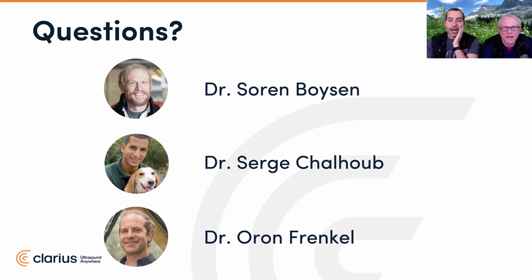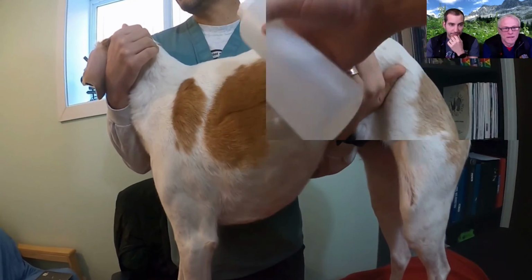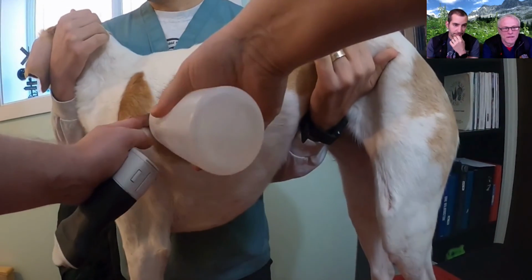That's what we do. We're actually doing a study right now using water. That's going to be very interesting. It's an ongoing study to see if that works just as well, and it seems to so far. We rarely use it up here. So how am I going to do that? Pull the skin down, a little alcohol here. Okay, yeah.